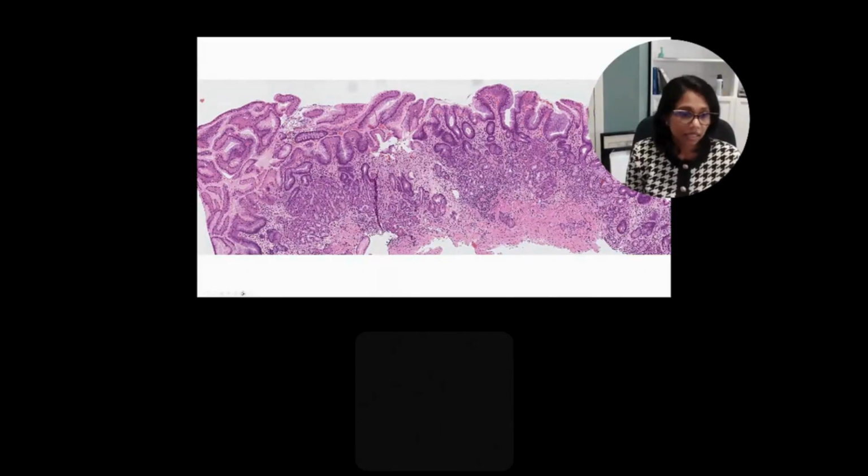But in some centers, gastrin is not readily available to all of us, and a useful feature would be to look for the absence of those fried egg cells. So the absence of G cells within these pyloric glands will help support your assertion that this is in fact antralization of the gastric epithelium.